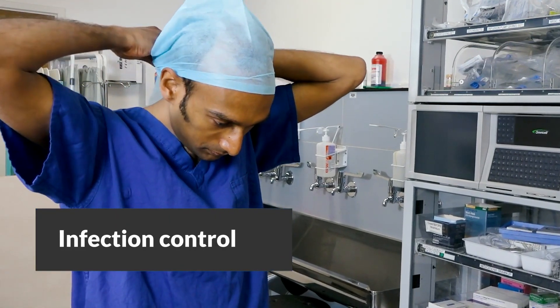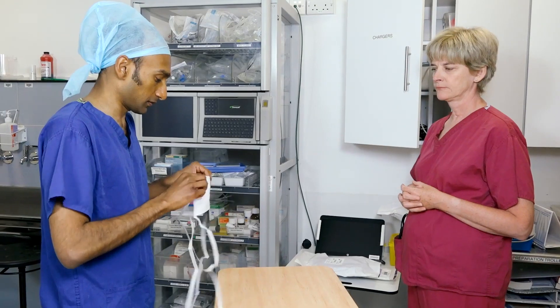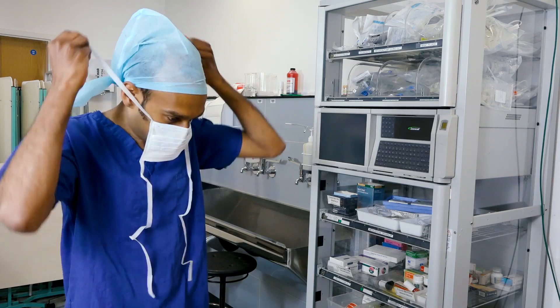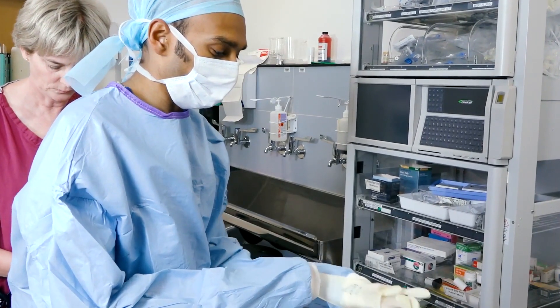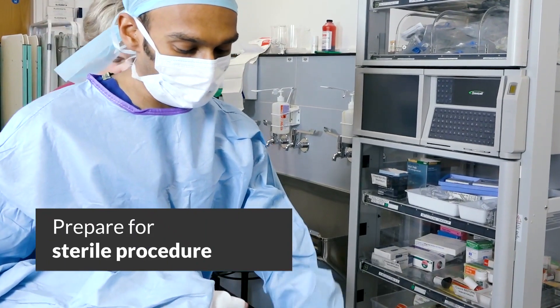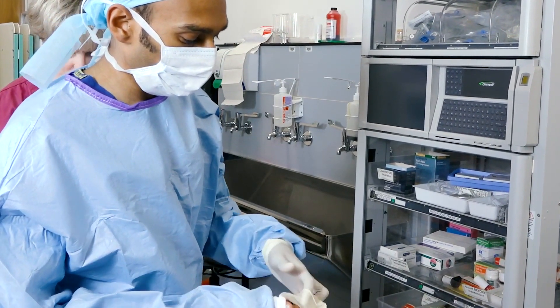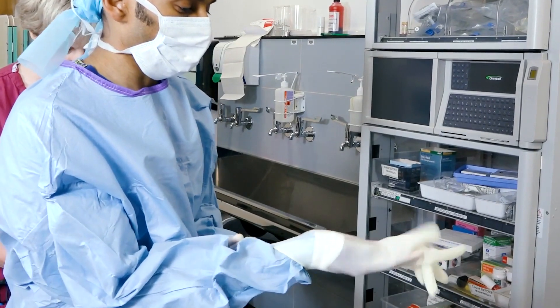Be sure to wash your hands before the procedure and apply the relevant PPE. Decontaminate your hands and apply sterile gloves and gown, then empty the required equipment onto your sterile draped trolley.